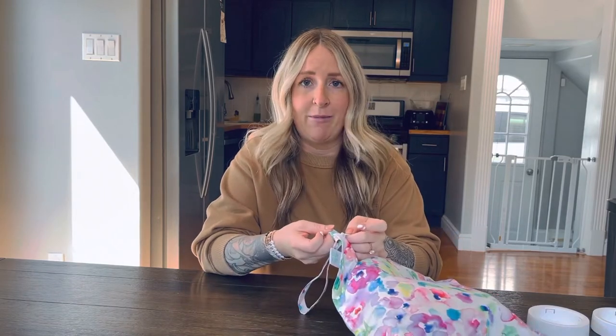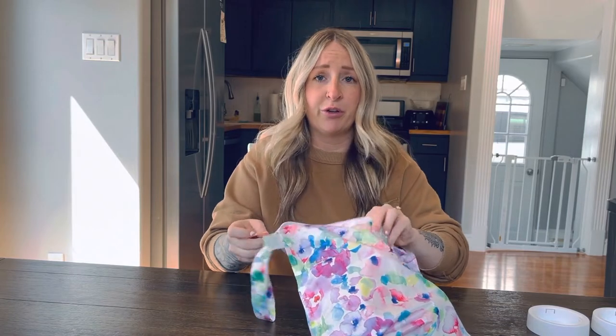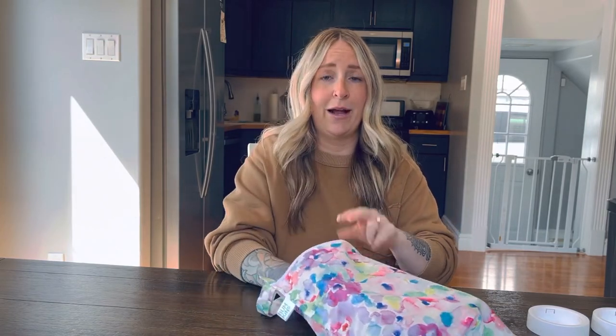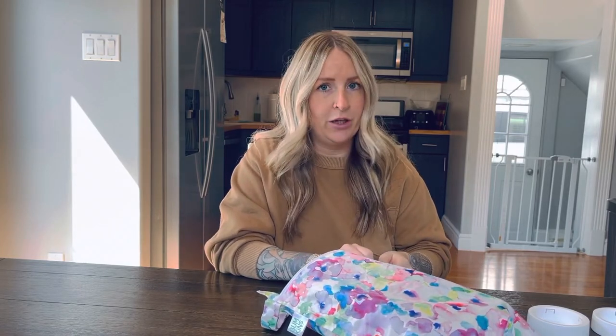All it means is you get a wet dry bag — I got this on Amazon, very inexpensive. You just put your flanges, your whole flange setup, into your wet dry bag and pop it in the fridge after your sessions. No tubing, because you don't want any moisture in your tubing, and obviously not the pump because of the motor. So just your flanges, no tubing, no pump — pop it in the fridge.